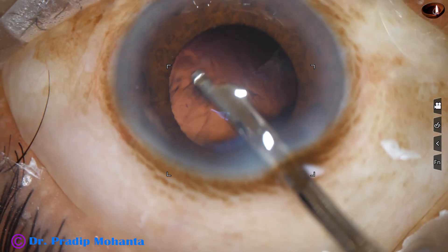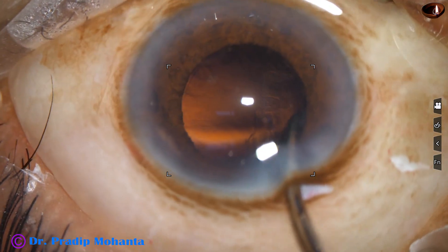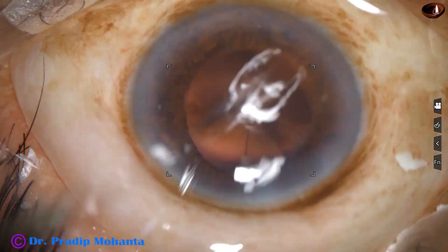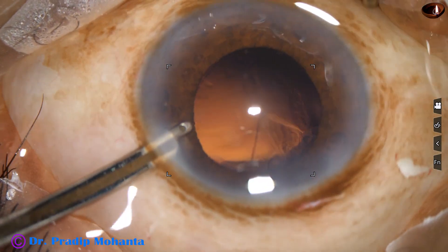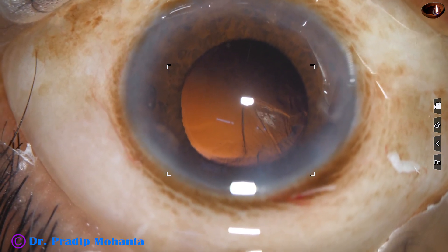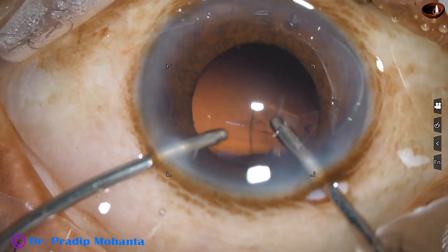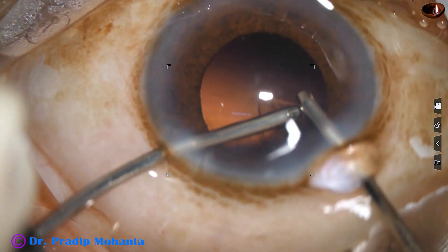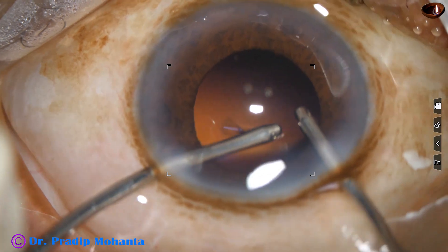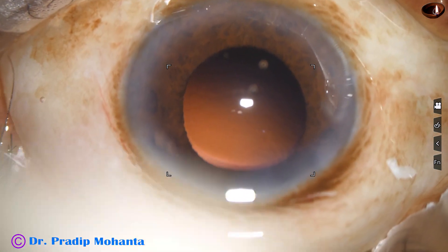This is a Simcoe cannula, 22 gauge. The cortex from the inferior part has been removed. The sub-incisional cortex is to be removed. The incision is small and the Simcoe cannula cannot be introduced through it, so the irrigation-aspiration cannula is used instead.